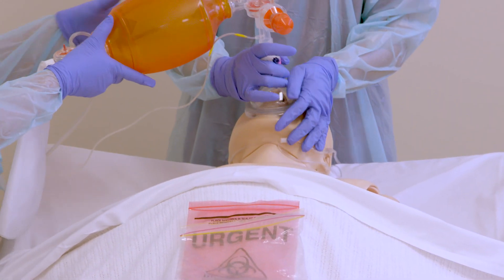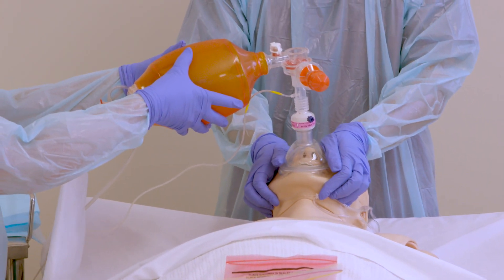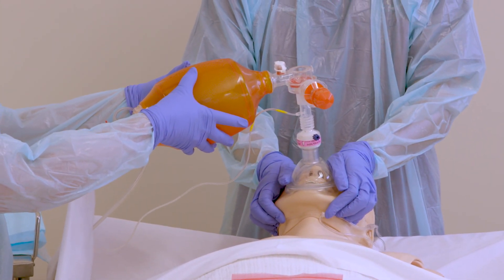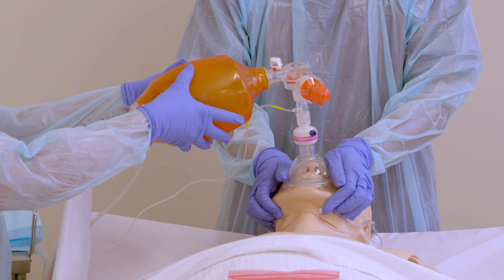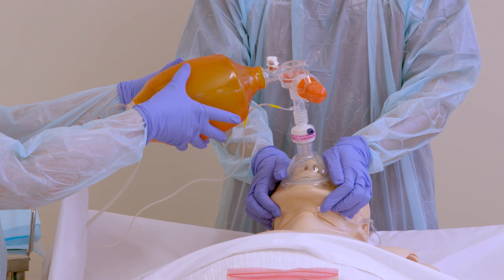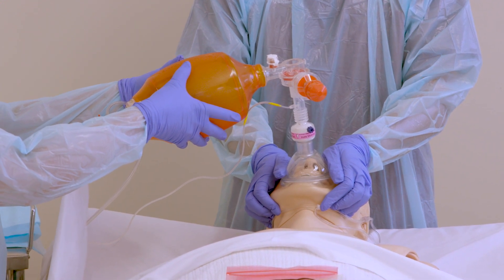Use a two-handed technique to ensure a good seal. Set the oxygen flow to 10 litres a minute and pre-oxygenate for 3 to 5 minutes. Do not bag at all.